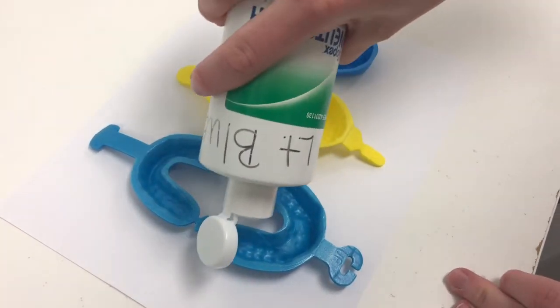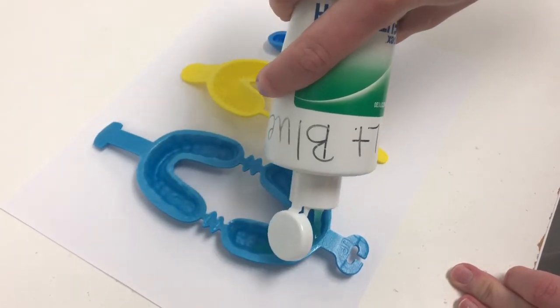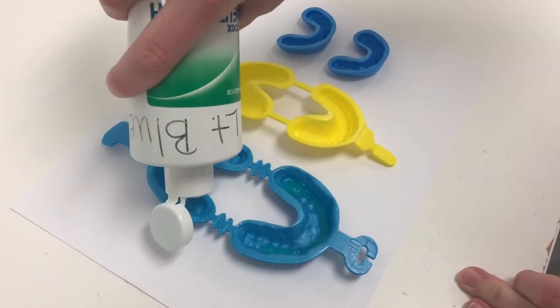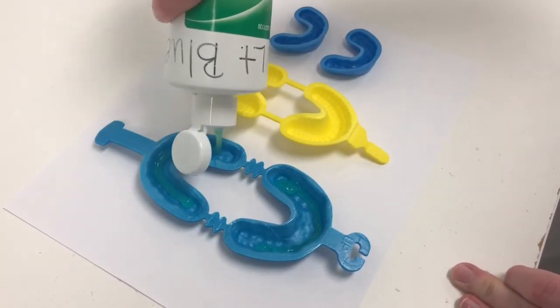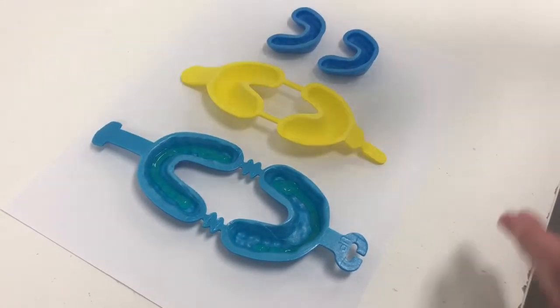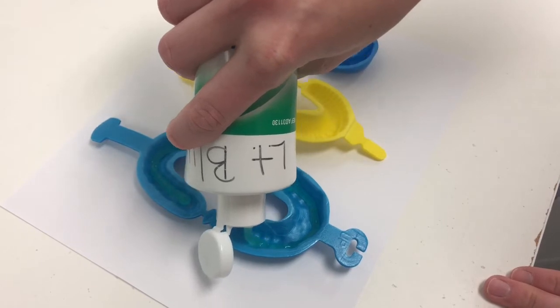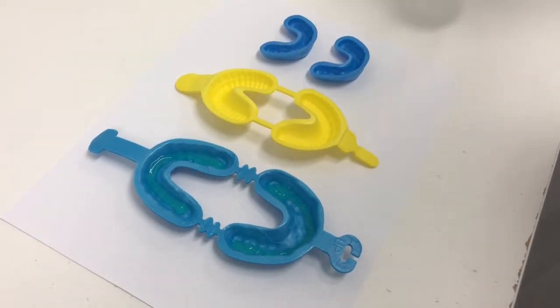I'm going to show you how much that is — I've already shaken it. You just don't want to overfill these; you only want to fill them a fourth to a third full.